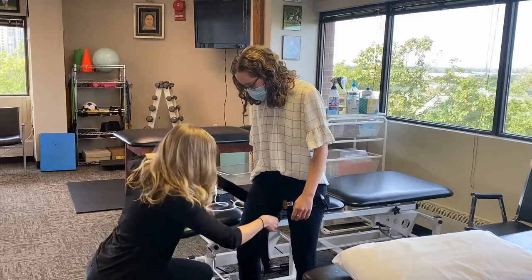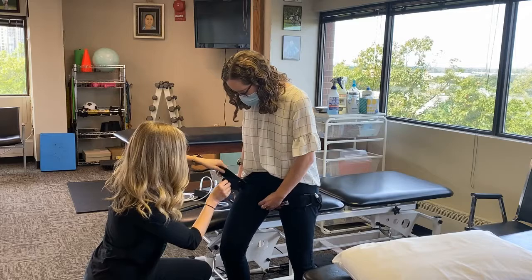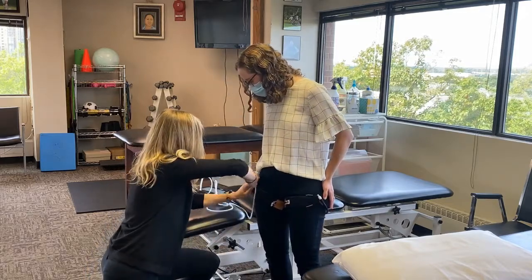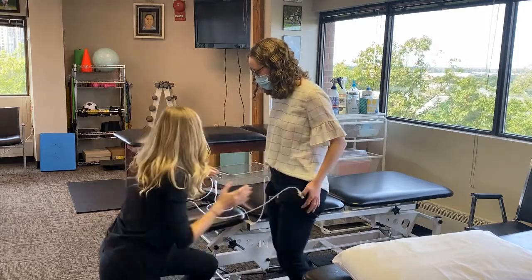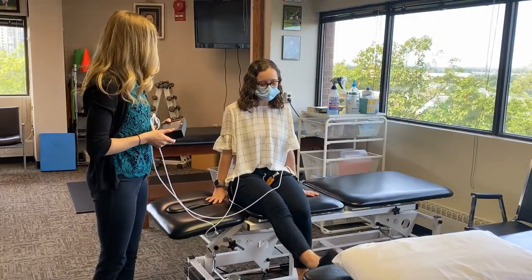We will now demonstrate how we apply this type of training to our patients. First, the cuff is placed at either the upper thigh or arm. The cuff is then attached to the machine where pressure is provided via air passing through the hollow tube. Once the desired pressure is obtained, the patient is asked to perform low intensity exercises, such as straightening the leg or sit to stands.